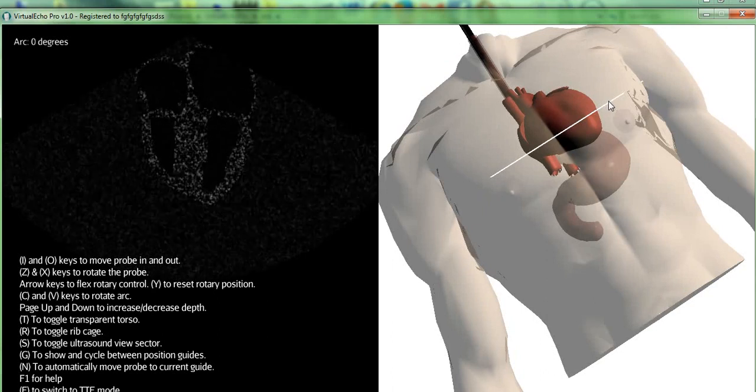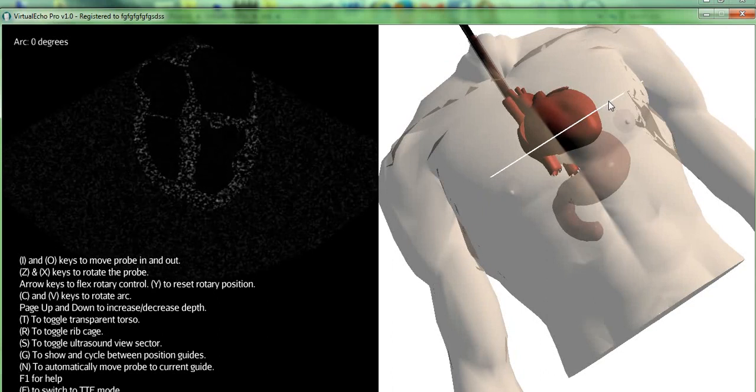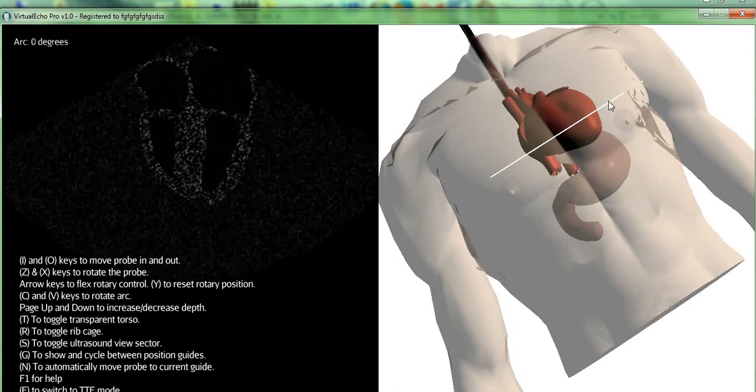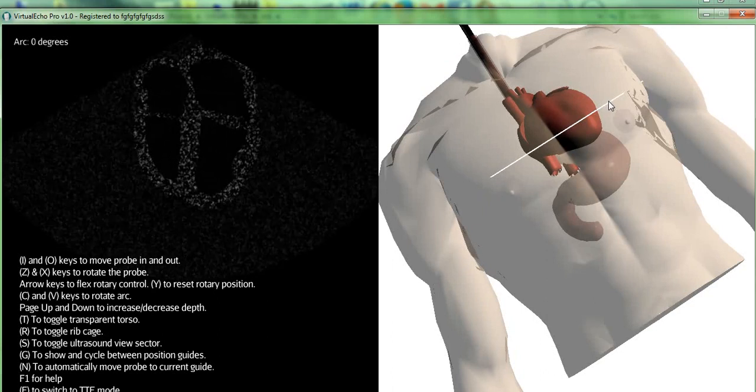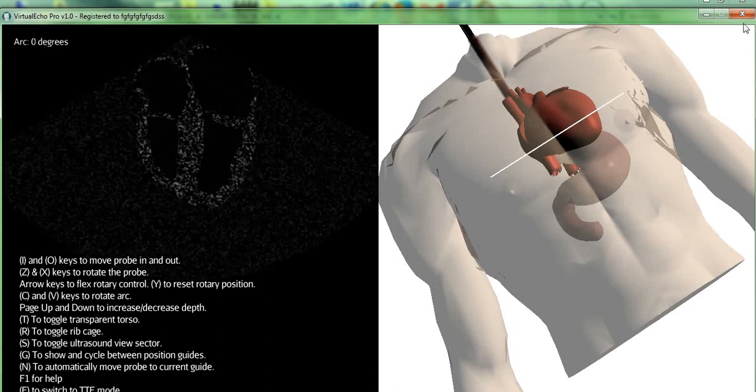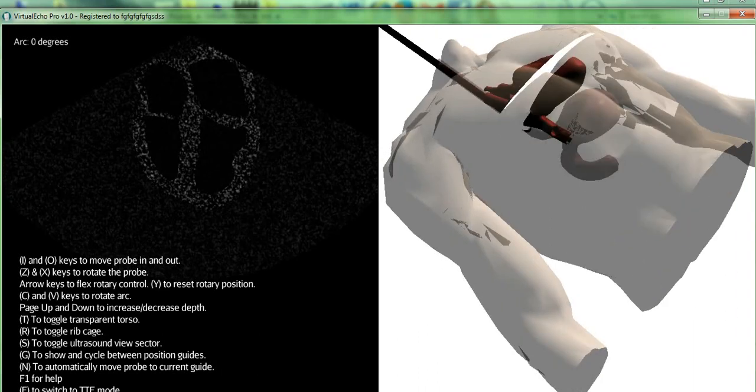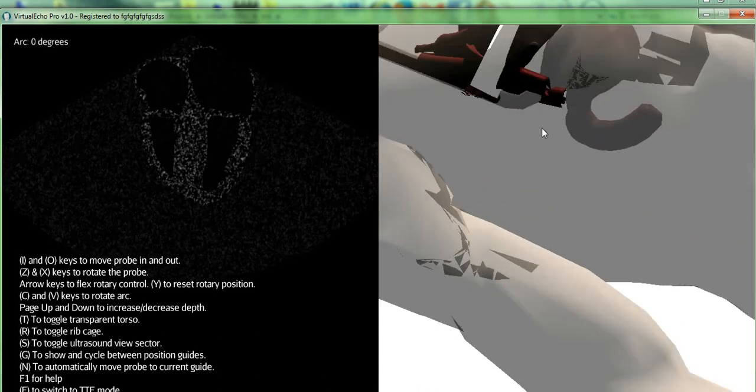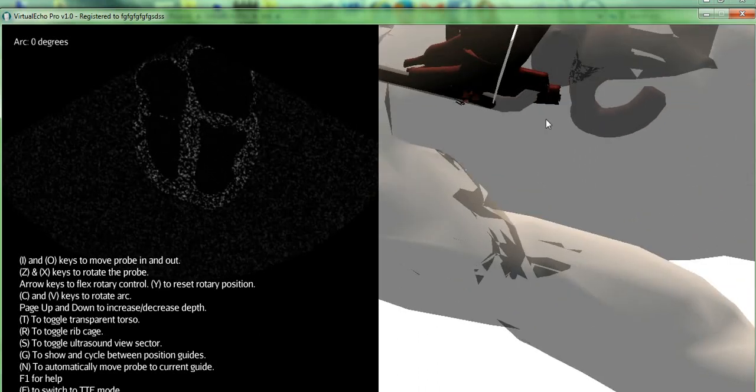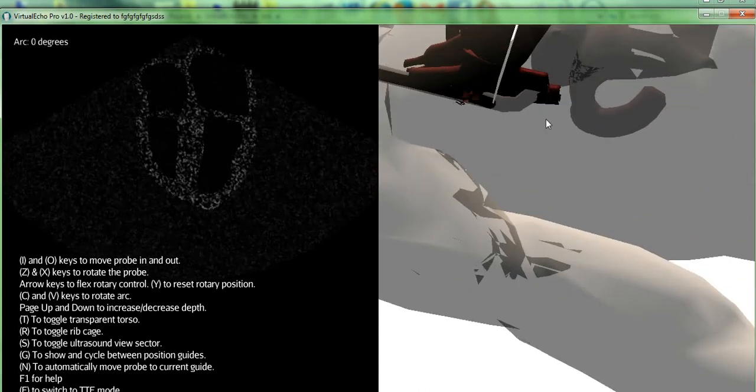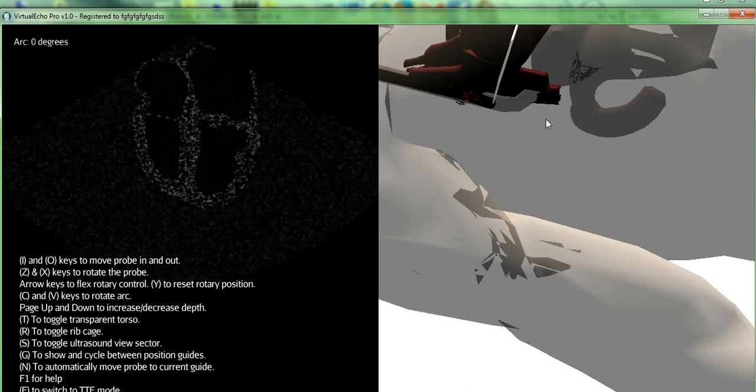The final motion is the arc, which you can control by the C and V keys. The arc motion is not a physical movement, but just a digital one. It means that the arc view rotates without the probe tip actually moving.